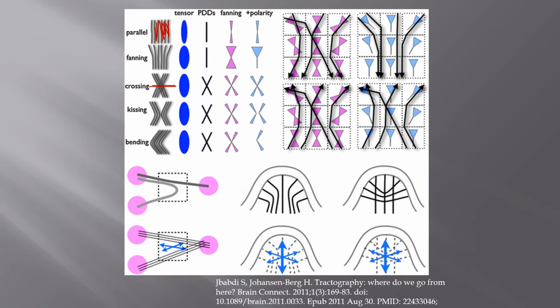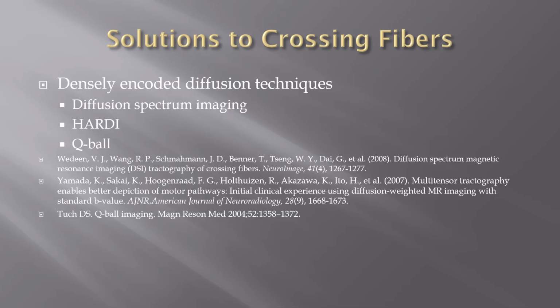fasciculus. So there's a lot of different mathematical models that can be used and applied to this, and depending upon the mathematical model, as you might guess, you can get different tractography appearances. So it's really almost, in a lot of ways, an art versus a science. Unfortunately, white matter dissections on anatomical specimens are very difficult and have been described more in art than science.